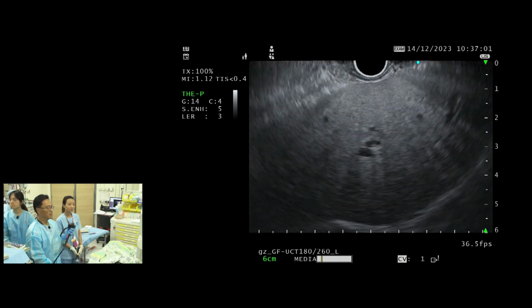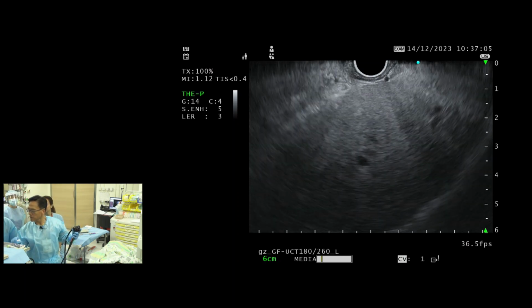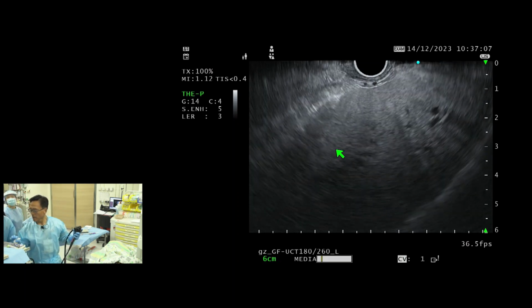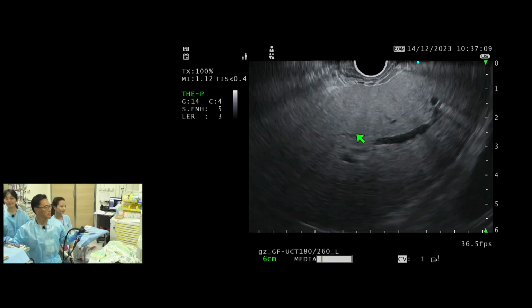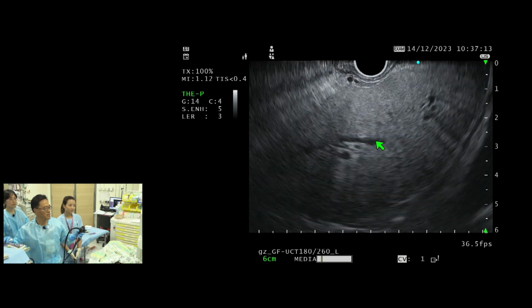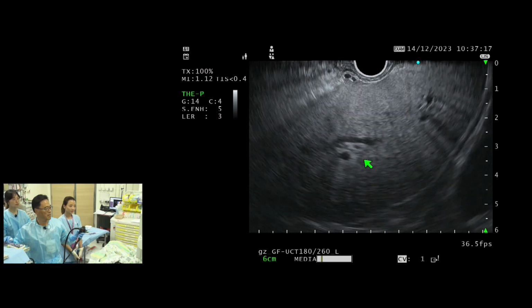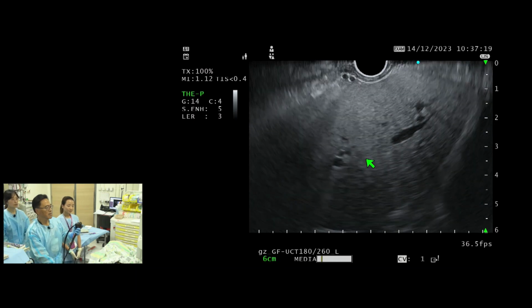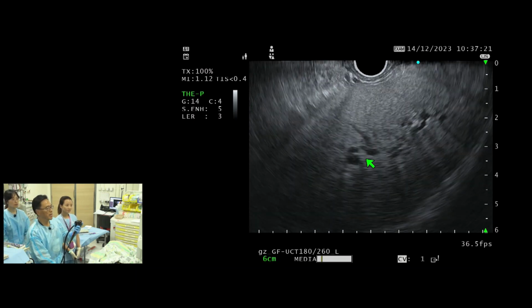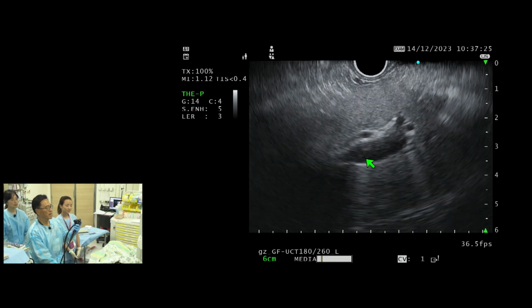So now we're going to take a look at liver anatomy, and let's get the pointer. Is this the? Here. Okay. All right. So this is the left hepatic vein, and that separates liver segment 2 from liver segment 3. And then as I rotate to my right, that's the left portal vein where the arrow is.